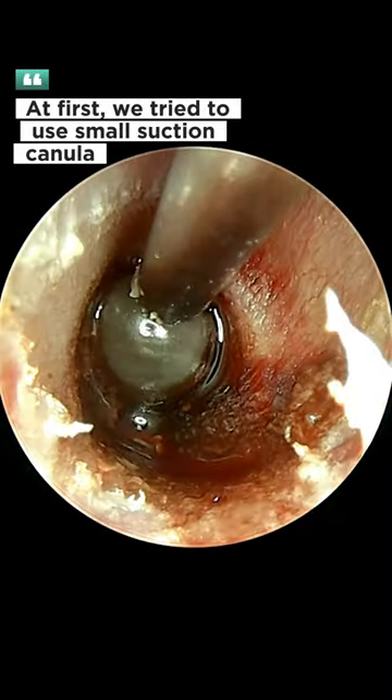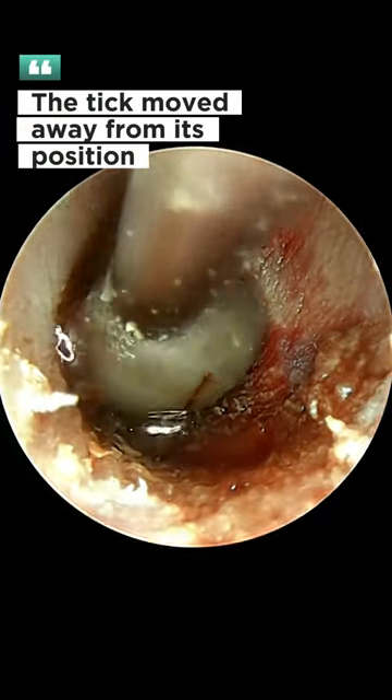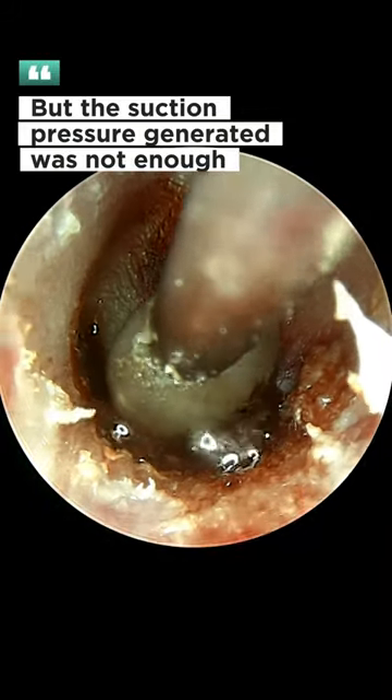At first, we tried to use a small suction cannula. The tick moved away from its position, but the suction pressure generated was not enough.